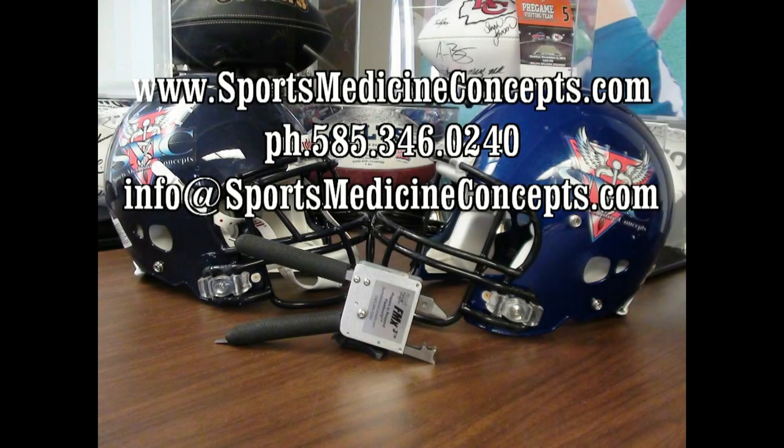This concludes our discussion on using the FM extractor to cut the Revolution bowtie style face mask fasteners. Should you have any questions, please do not hesitate to call on Sports Medicine Concepts.